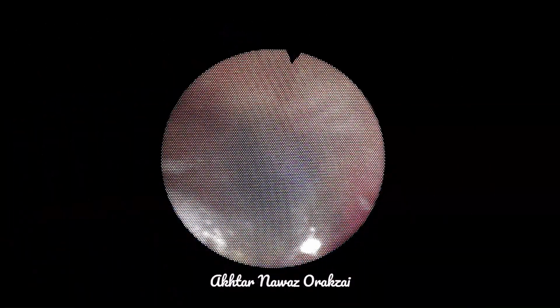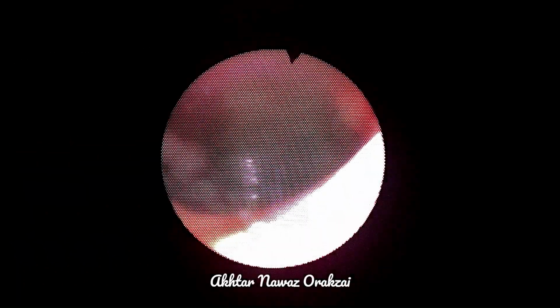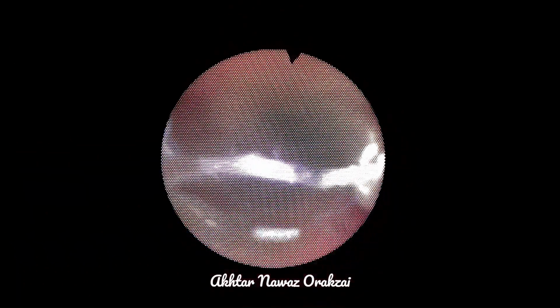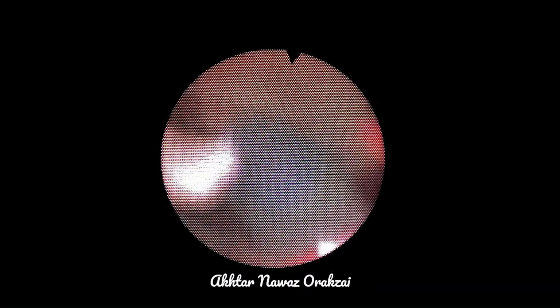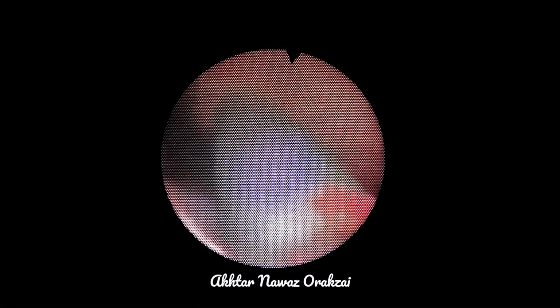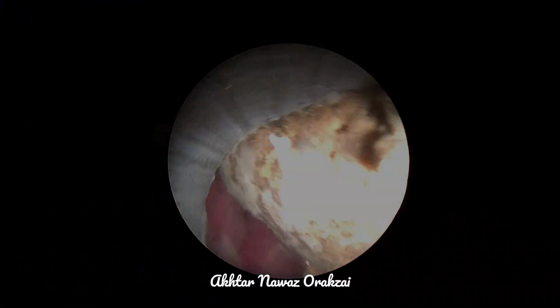So here the largest dilator has been passed, and now the Amplatz sheath is about to be passed over the Alken's dilators. Here you can see, and then we go to the tract suprapubically with the standard nephroscope and its lithoclast.